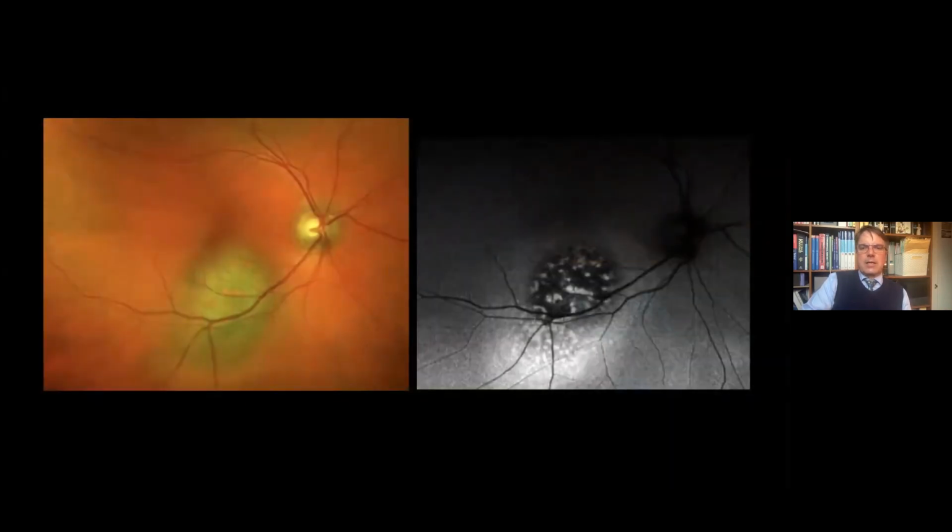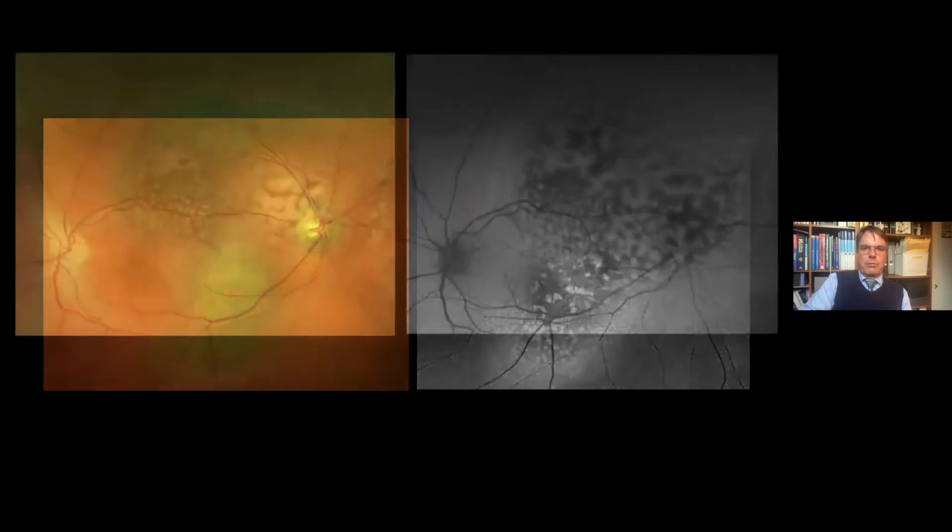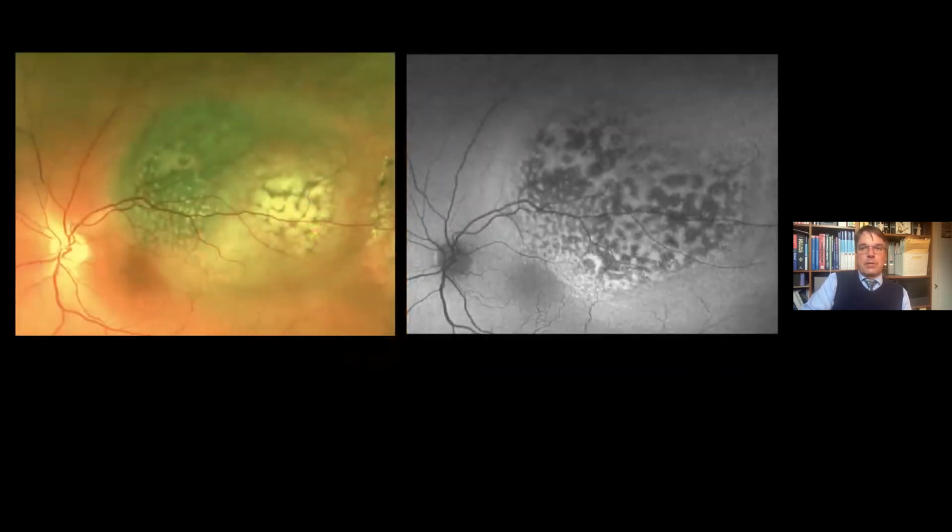So this is a classic example. You can see the tumor here on the left, and you can see the clear orange pigment there. But sometimes in clinical practice, you can't see it as nicely as that. What helps you a lot is these patchy, like a cow patch, really, patches of autofluorescence there. This is typical. This is lipofuscin, orange pigment, and they really shine up like these patches on autofluorescence. So this is one of the 6 risk factors that you can really prove with the autofluorescence, and it helps you in difficult situations.